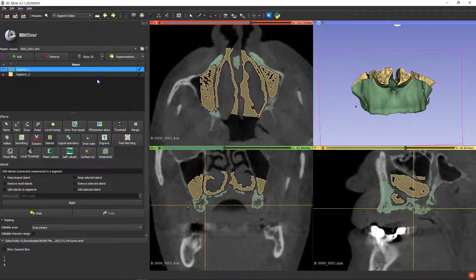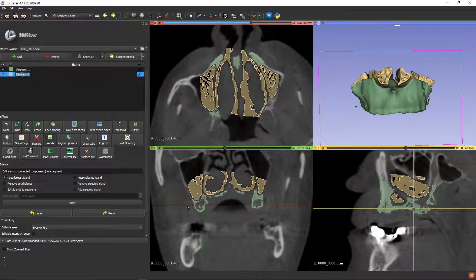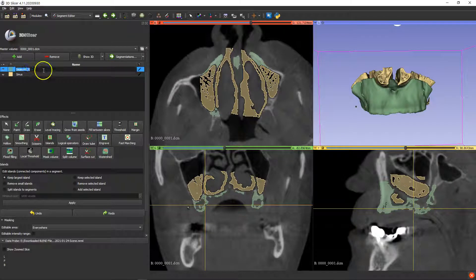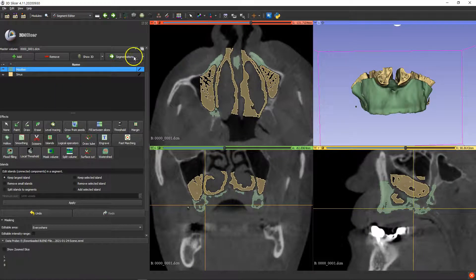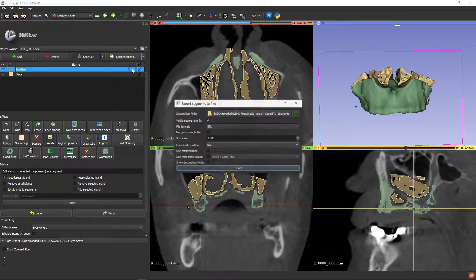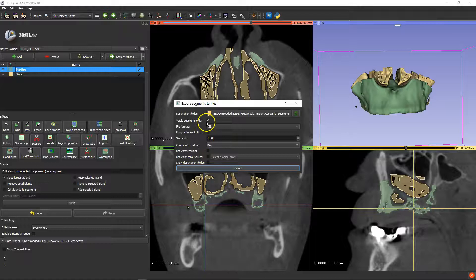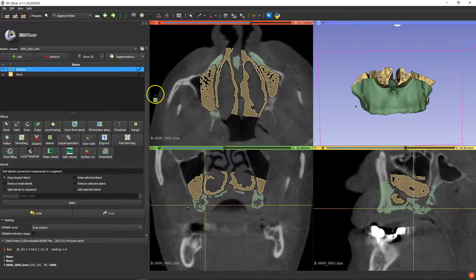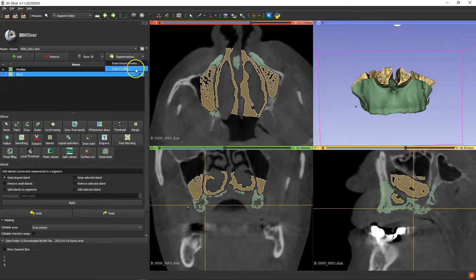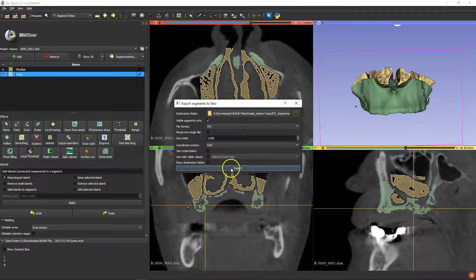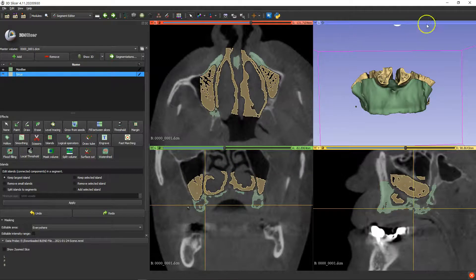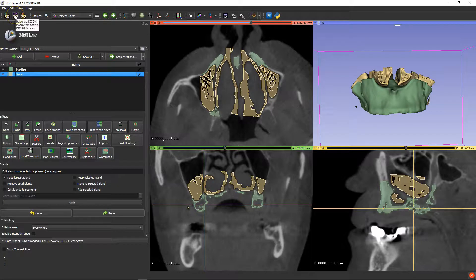We're going to export these into Blender. The one I'm going to call Sinus, and the other one I'm going to call Maxilla. Export the one, make sure you choose the file that you're exporting to, and then export the other one as well. And that's it — we can save this and then go to Blender to do our implant planning.